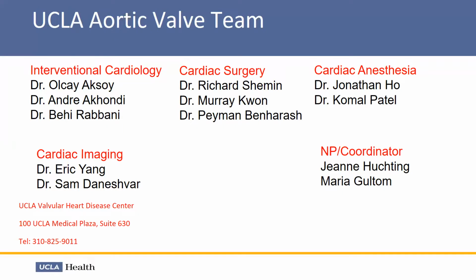It's helpful to come up with scoring systems or risk factors for the Medtronic valve, actually very useful. But in clinical practice, ultimately it ends up being about how high the valve is. I can argue it's high or low, I can argue this membranous septum is long or short. Ultimately, you have to have a landing zone. If the landing zone is too low, you're going to get close to the left bundle. If it's high, you run the risk of embolizing. But then you put it as high as possible and still stay within the annulus.